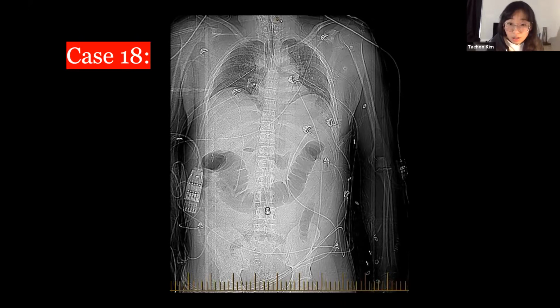The other test you need is ultrasound. Yes, ultrasound you also ask for because you want to see the etiology of the pancreatitis. I'm sure you all already know better than I do. Most common types are alcoholic pancreatitis or gallstone pancreatitis. To rule out gallstone pancreatitis, CT is not the best modality because we don't catch all the stones. So we do ultrasound to look at the distal CBD to see if there are any stones, like most of us said here. Hope that answered the question.